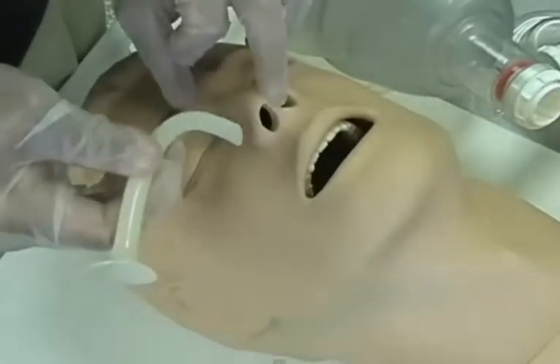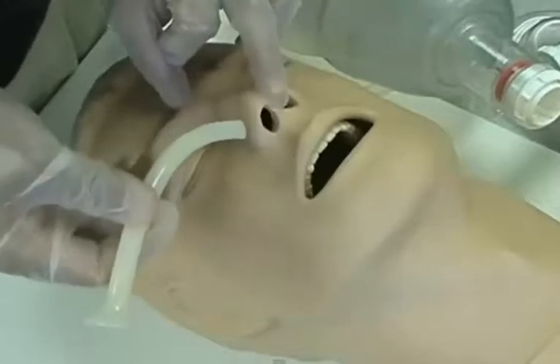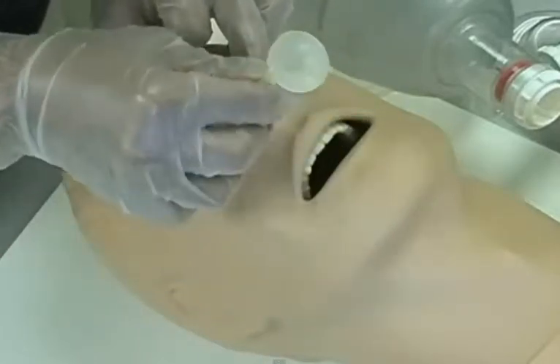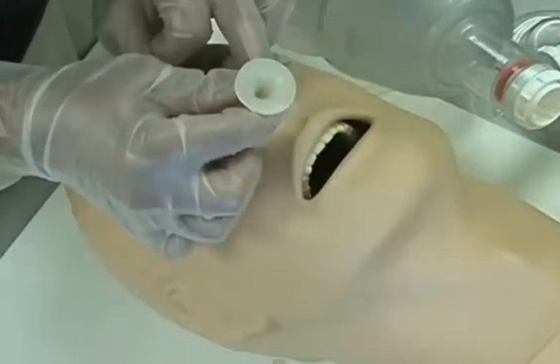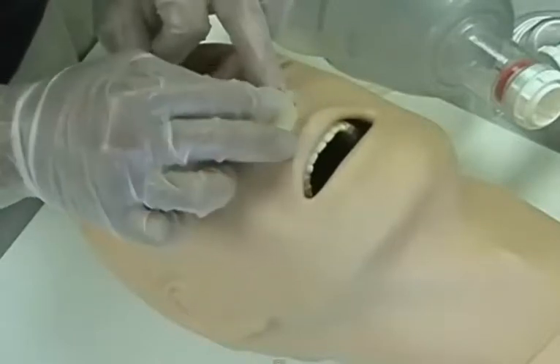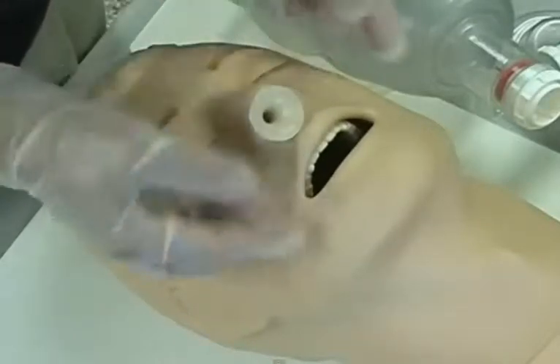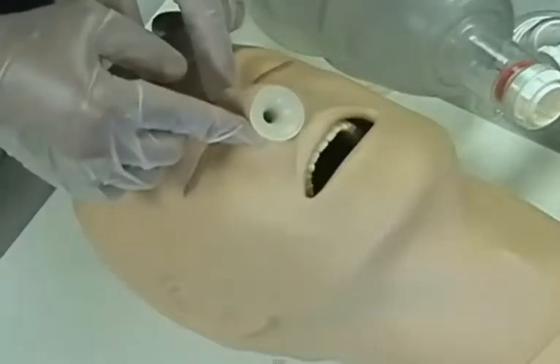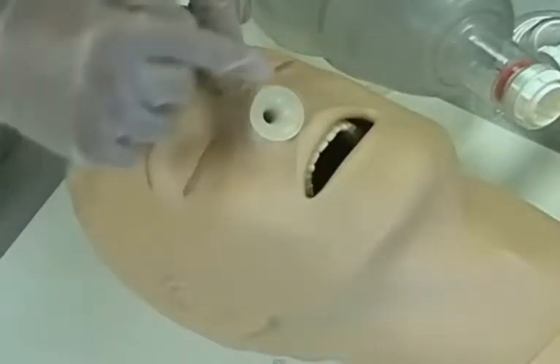Pulling back on the nostril slightly and very gently, we'll just open up the nostril a little bit. And the airway should be placed straight back with no force really. It should be very easy to slide in. If we met obstruction, we wouldn't want to force our way in. So you see there, that's why they call it a trumpet.